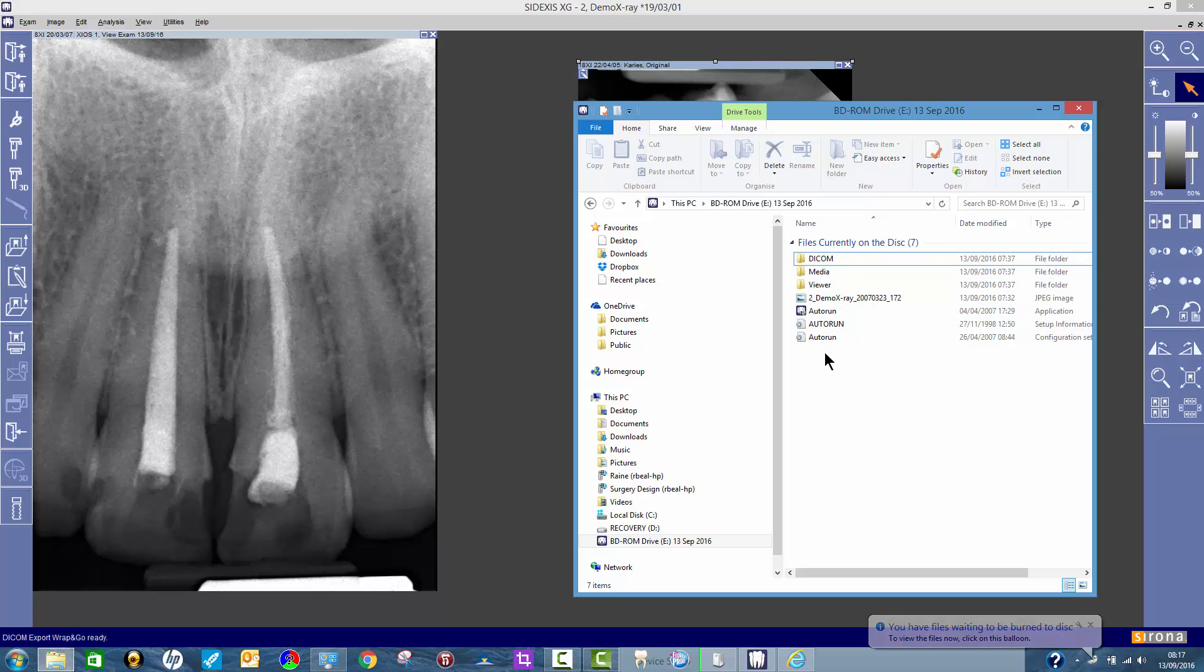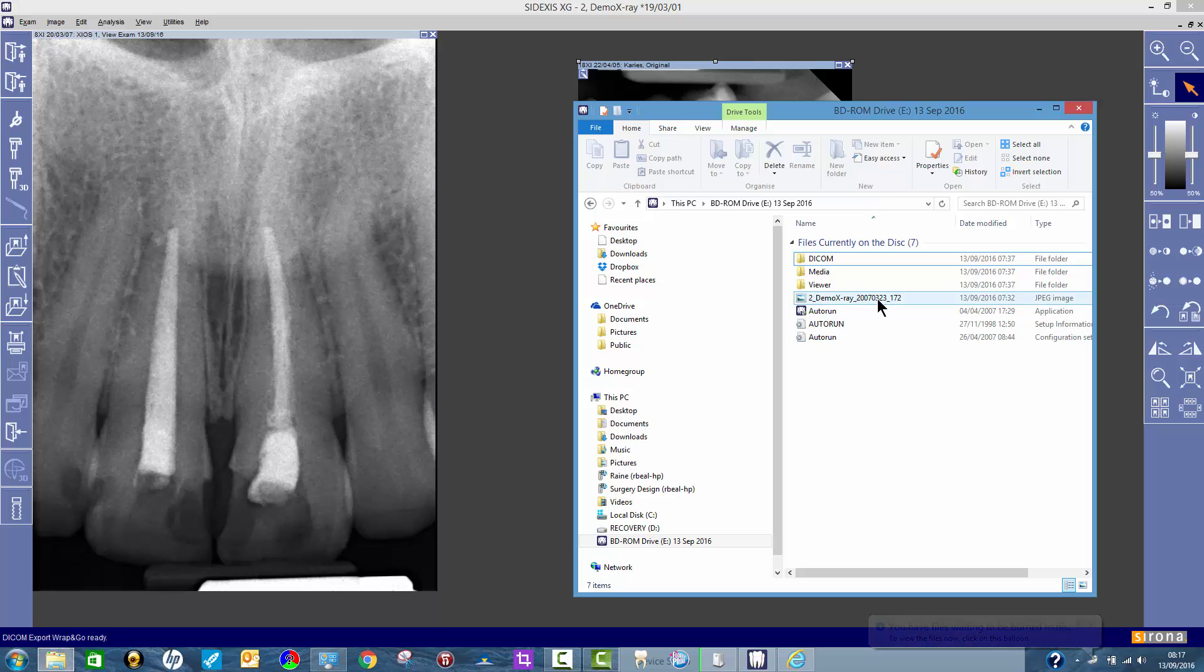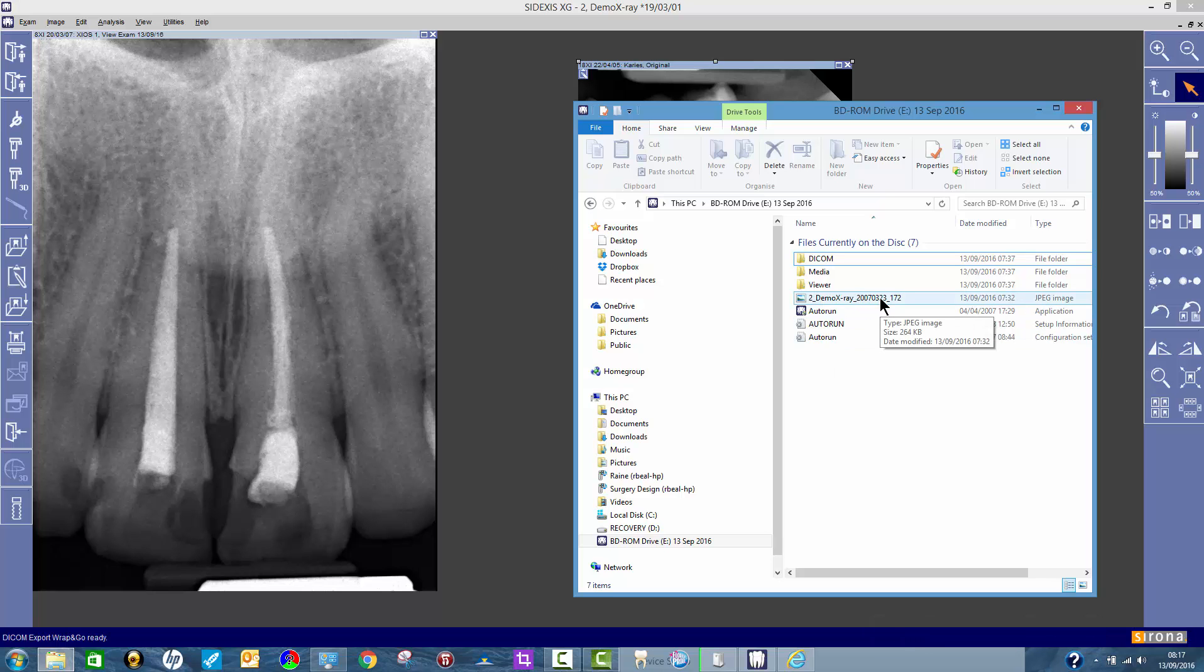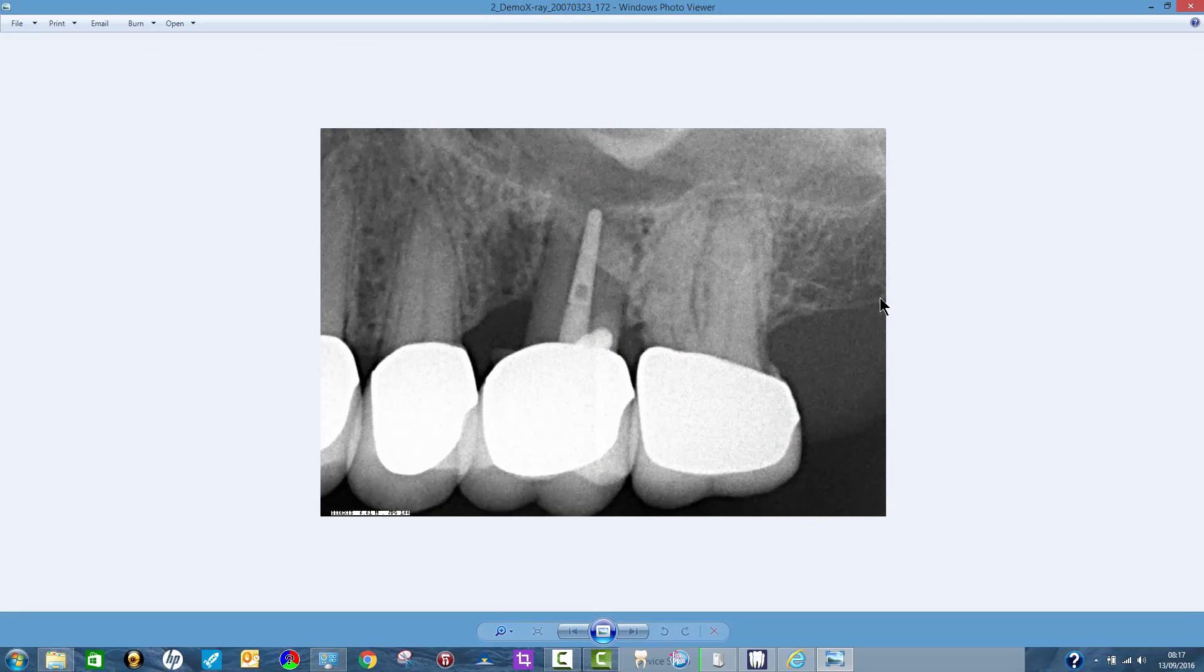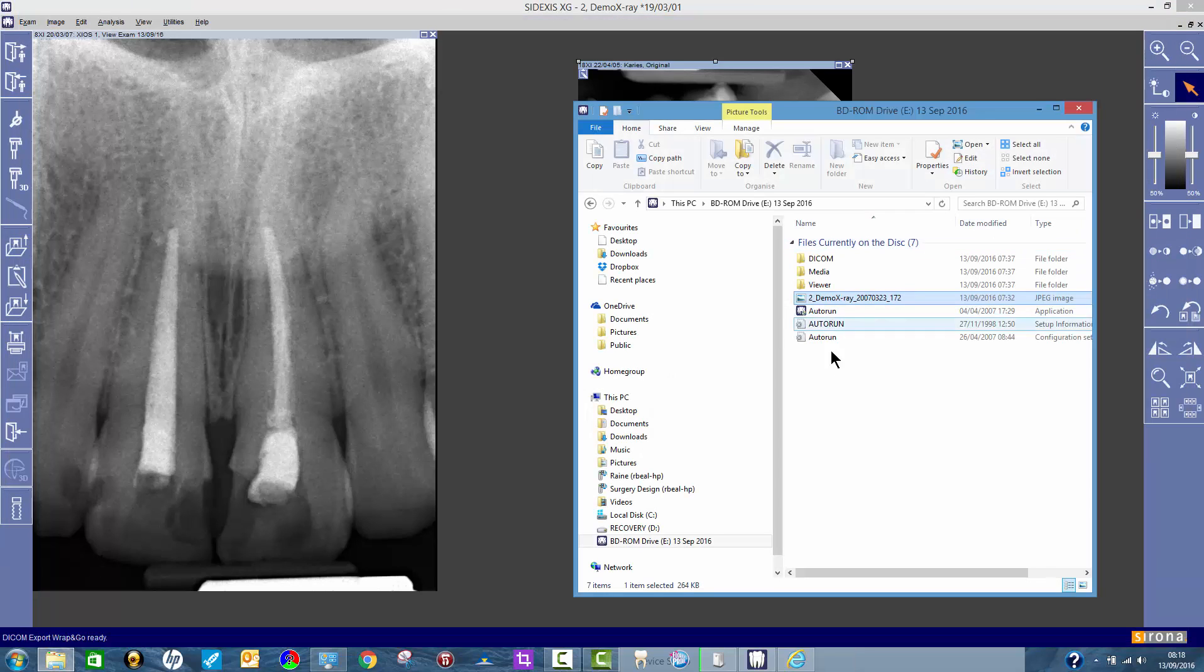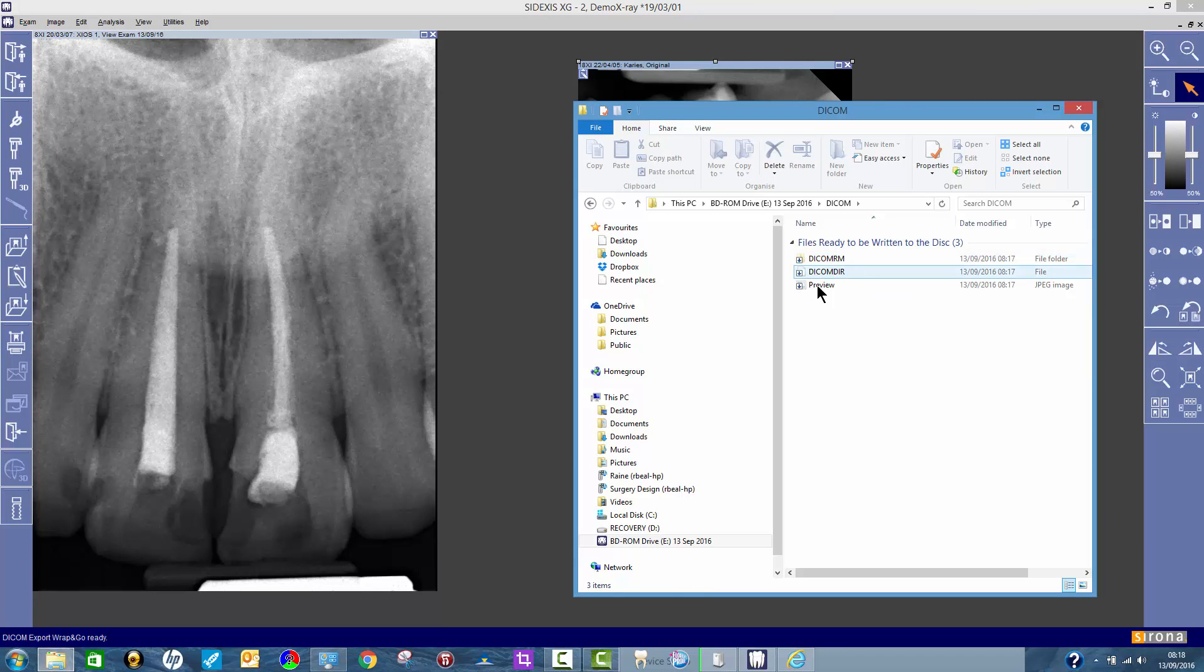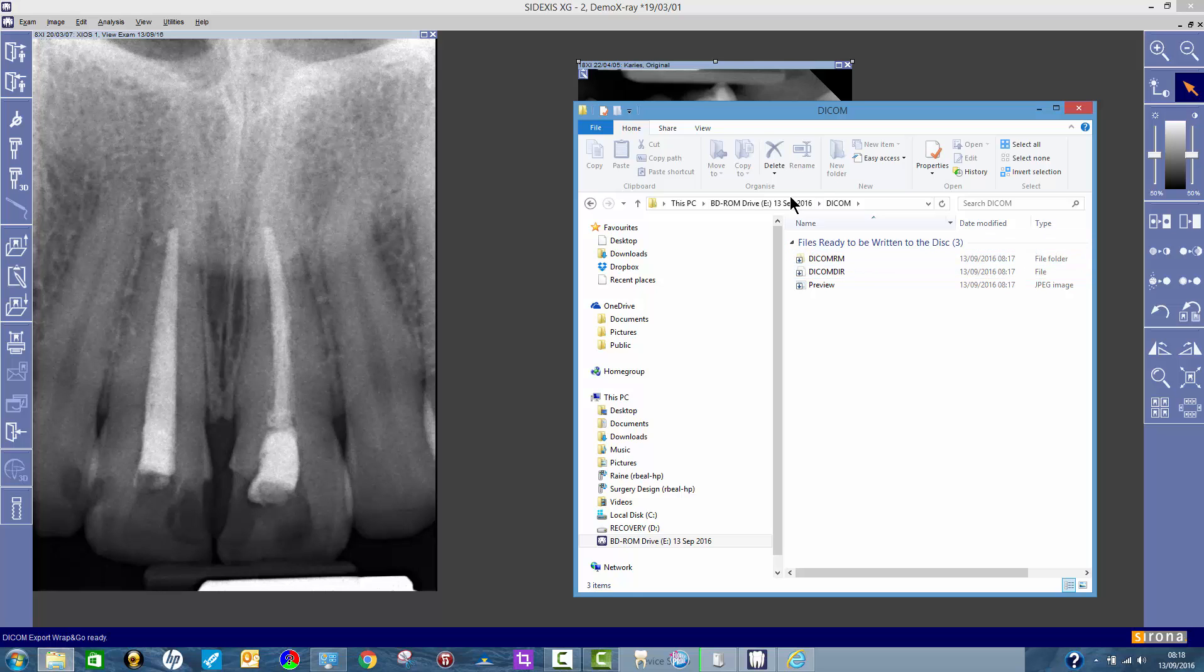What this does is, you see here, this is a JPEG image. There's an image that I burnt earlier. Yours would arrive in there as JPEGs, so anybody could read those. But equally, if it's somebody that's got DICOM format software, the DICOM files are also in there. DICOM is just a standard image format. It stands for Digital Imaging and Communications in Medicine.